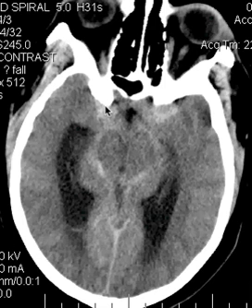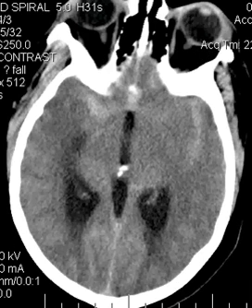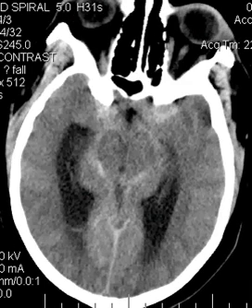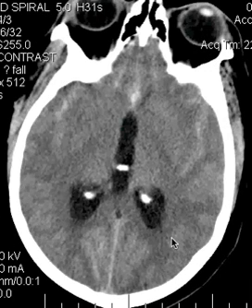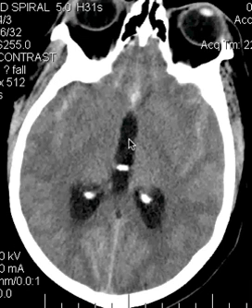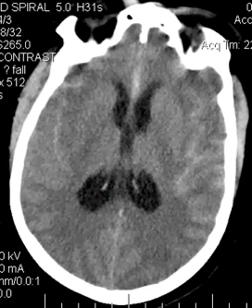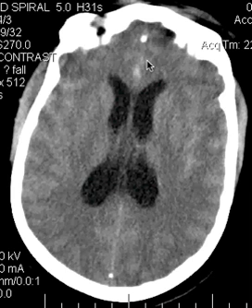Going up a little bit higher — there's the interpeduncular cistern. You have high attenuation material, and that's blood hemorrhage, in the quadrigeminal cistern and lateral parts of which are sometimes called the ambient cistern. You see blood in the subarachnoid space of the sylvian fissures bilaterally. Here you see a little bit creeping into one of the sulci in the inferior frontal lobe, and there's also some blood tracking in the interhemispheric fissure anteriorly.